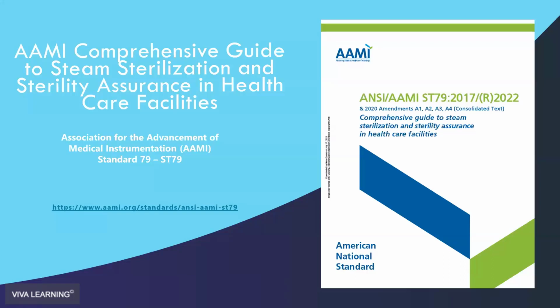They have to tell you how many parameters are measured or indicated by that indicator. The good news is that if you're using a pouch that has an internal indicator that meets one of the standards of care, but when we talk about the types of indicators, you'll see how important that is.